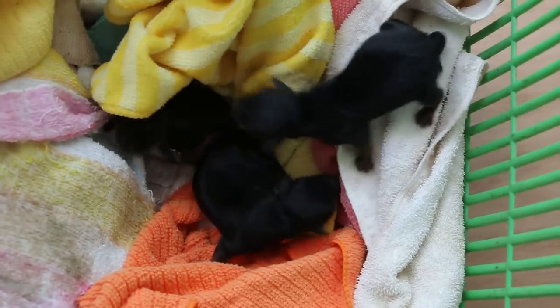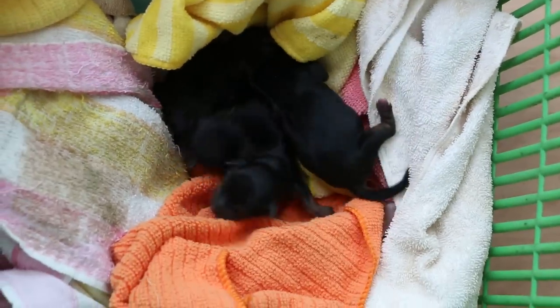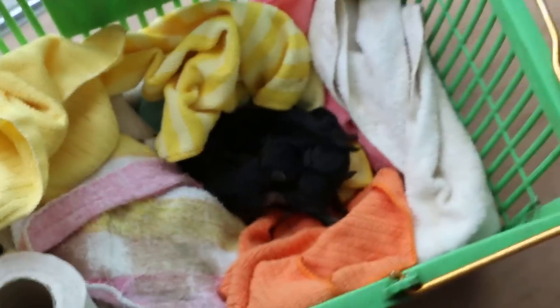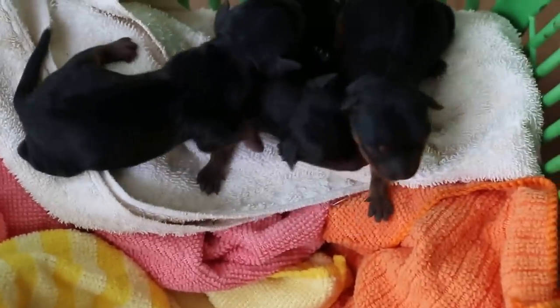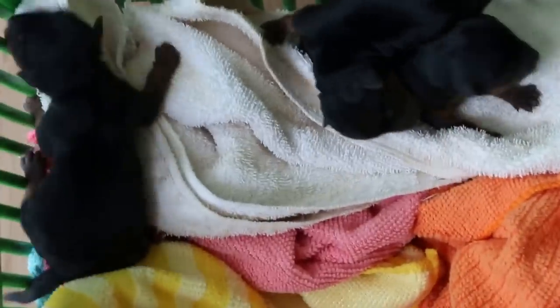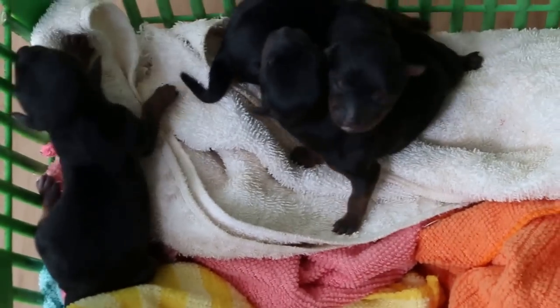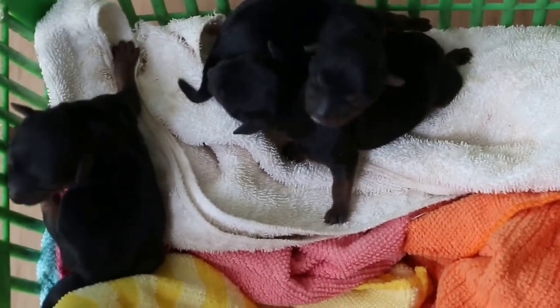57 is okay, right? For small breeds, yeah. Chihuahua also, right? Okay, the mother can go home already. F1 is on its own, one uterine horn, and the other two in one. So actually three. This one alone is quite long, you can see. And the other two are stuck together. So you can see, very difficult to give birth by themselves, because it's all obstructed.